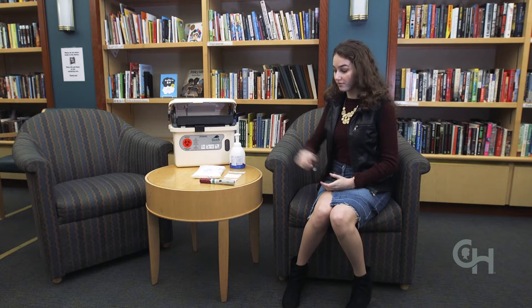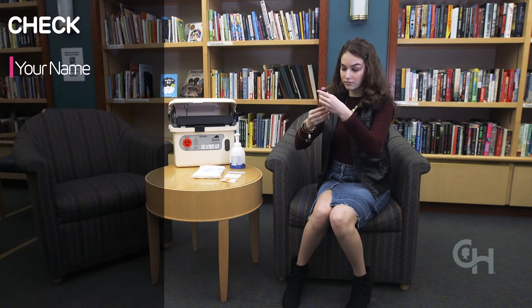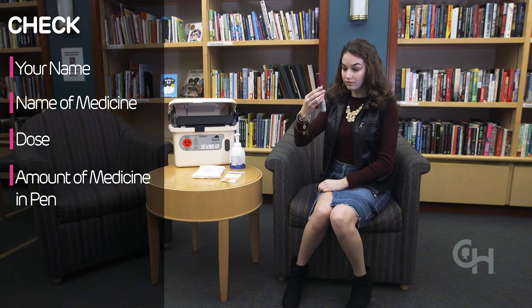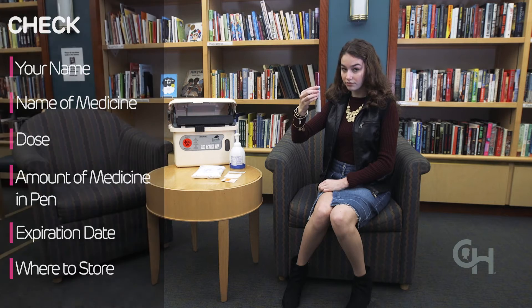Read the label on the pen every time you prepare the medicine. Check the label for your name, the name of the medicine, the dose, the amount of medicine in the pen called the volume, the expiration date, and where to store the medicine.